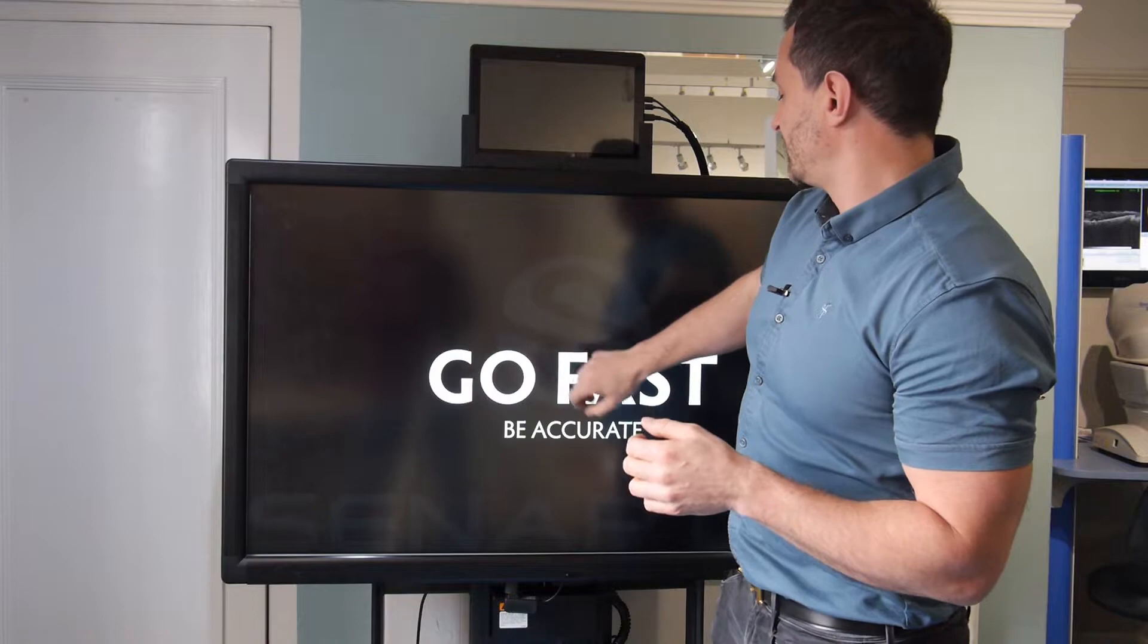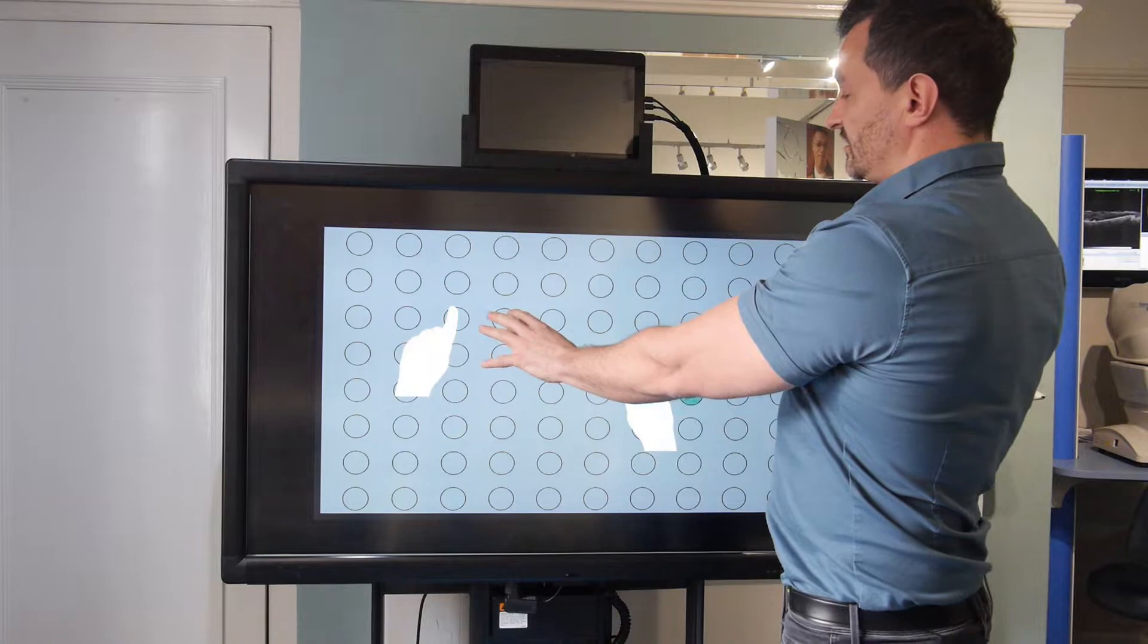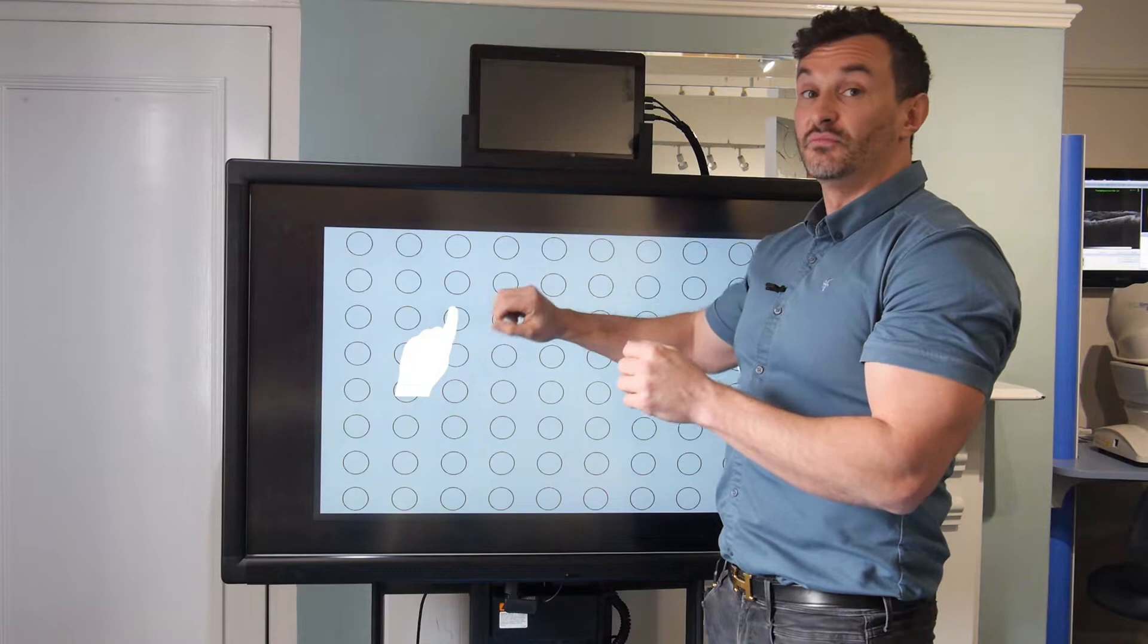So this test is all about being fast and accurate. This unit is going to be illuminated like this. We're going to have a green target that's going to turn up and we have to make a swift, rapid, accurate movement and turn that light off. This is all about being fast and accurate.